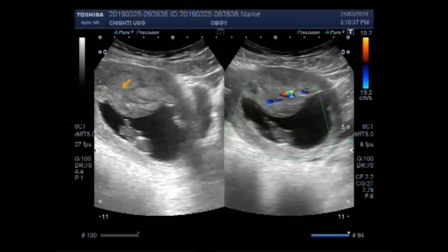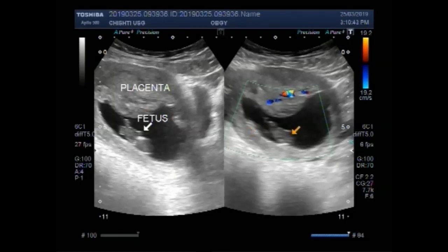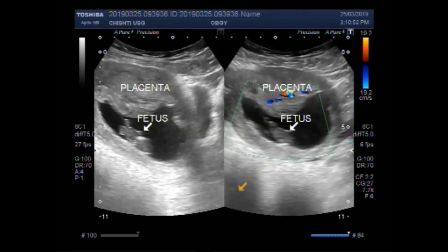Here you can see the placenta, and this is the fetus. Here also this is the fetus, and this is the small placenta attached anteriorly.